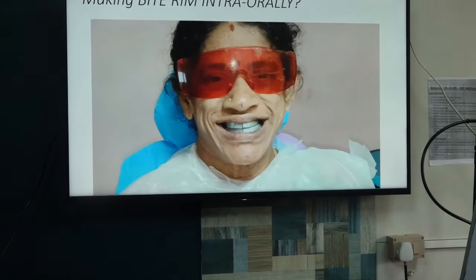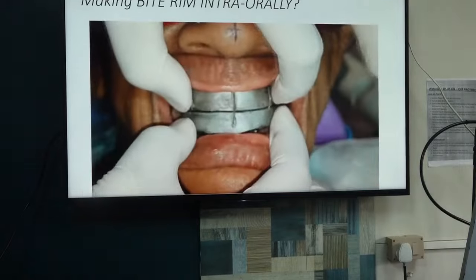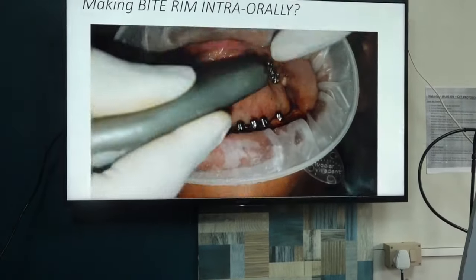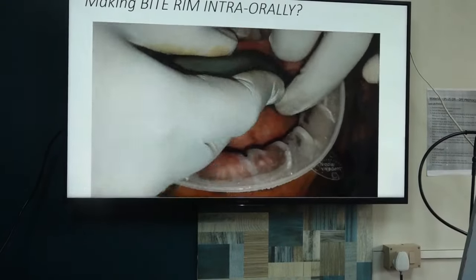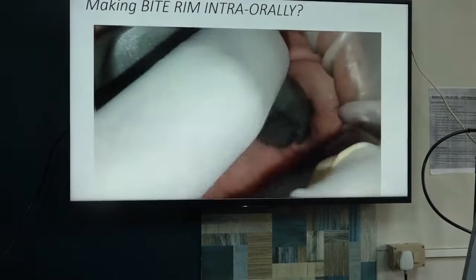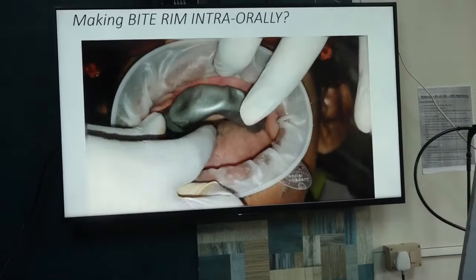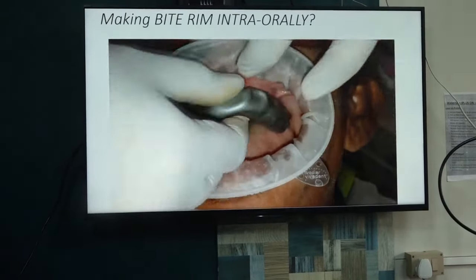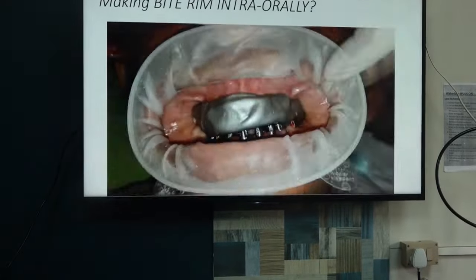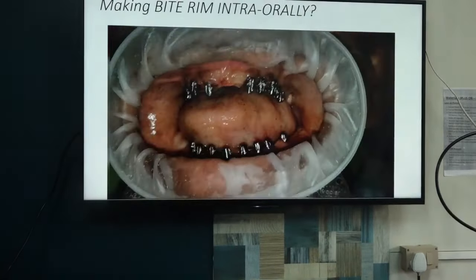So this is after finishing the jaw relation. You have to finish the upper bite rim first. You know the protocol: 1 mm or 2 mm of exposure incisally, labial fullness, buccal corridor, correct VD, correct occlusion plane, ala-tragus line. So these are all basic jaw relation steps. That is a separate class. Next one, this again repeats.